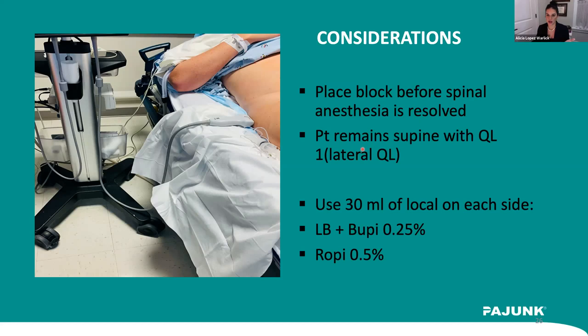I keep the patient supine and I place the QL1. I have placed QL3s before, but if it's my regular day routine stuff, I'm gonna place that QL1 because it's fast and it's effective, and I can place it before anyone even really knows I'm there.